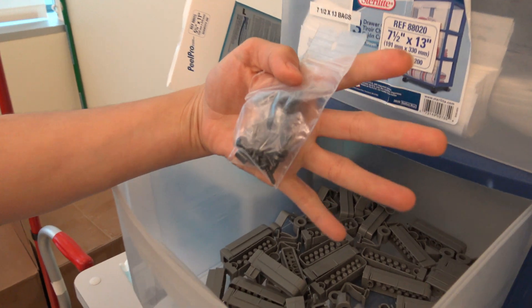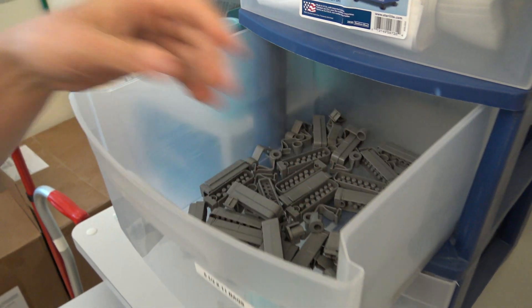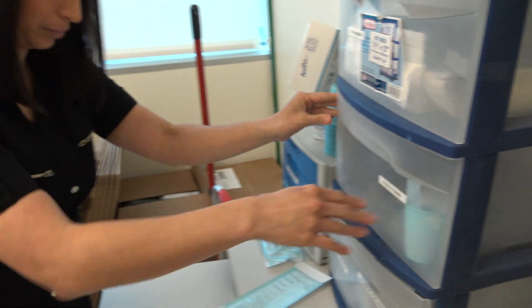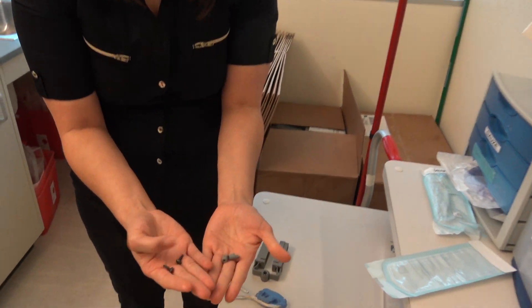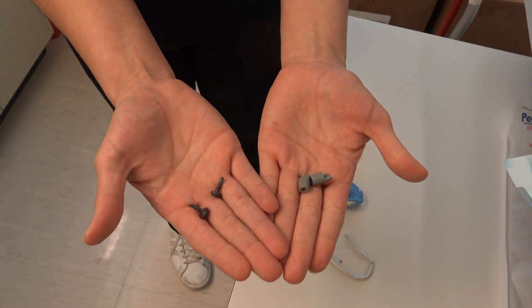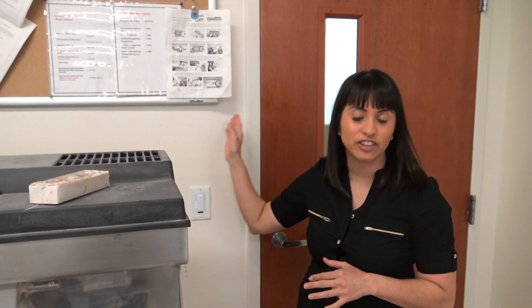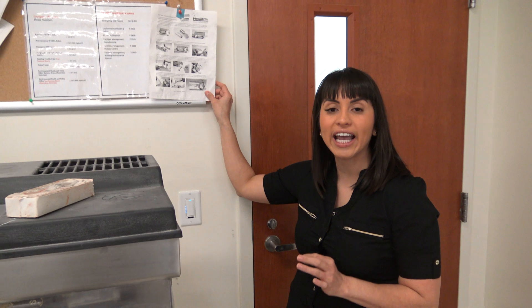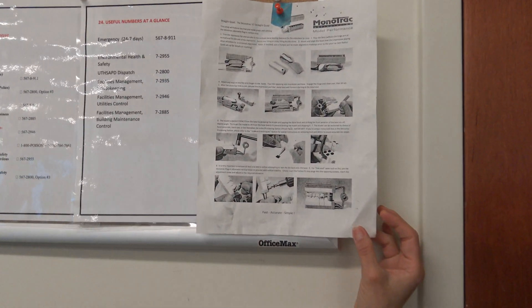These will be utilized if you're doing a distal extension, and this is what the screws look like. In addition to this helpful video which will go over each step for utilizing the monotrack system, there's also a handout that can be found pinned to the pinup board in each one of the labs.